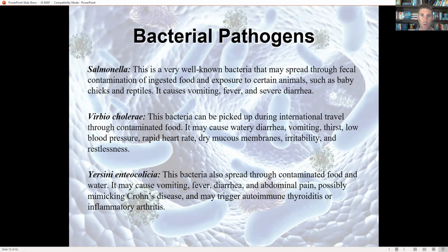Typically they're going to the hospital because they're in a significant acute crisis, but you may see them show up just not at levels that are high enough to be diagnosed with that specific infection, but still the genetic components may be elevated.